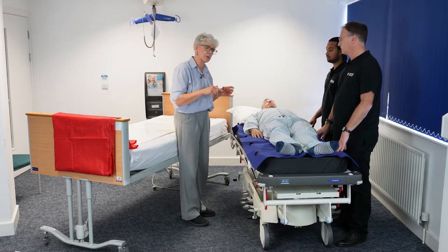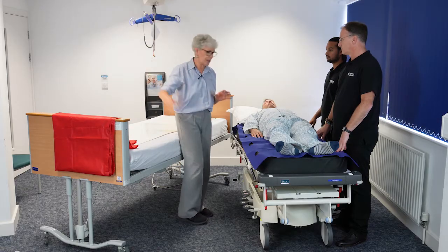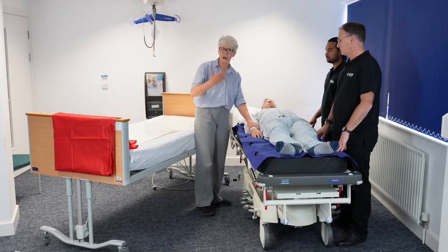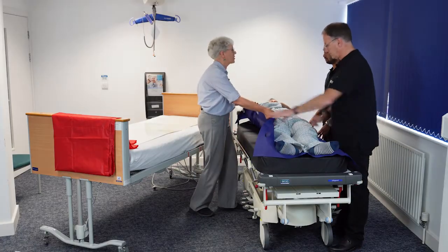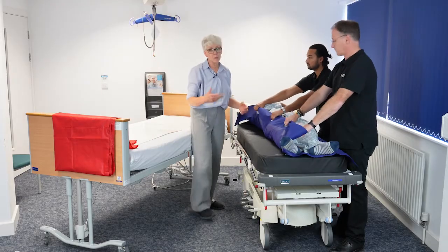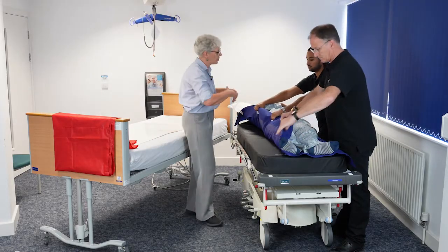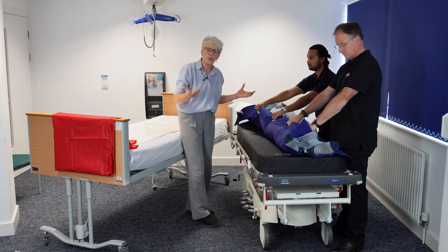The first thing we're going to do is position the transfer board and the slide sheet in place. For this we're just going to very gently bring our patient into a slight lean to one side. For this technique you need a minimum of three people, and depending on the weight of the patient and any other risk assessment issues you may need more.